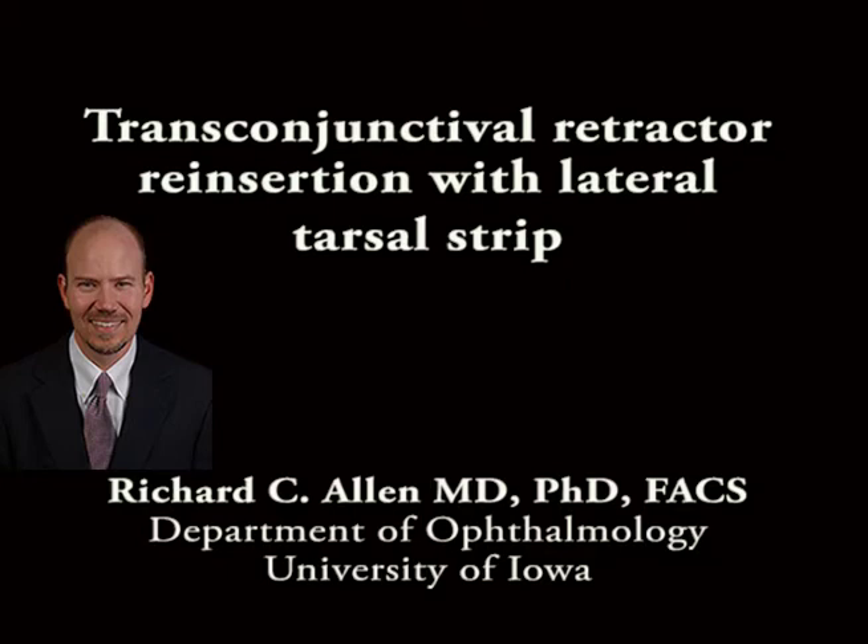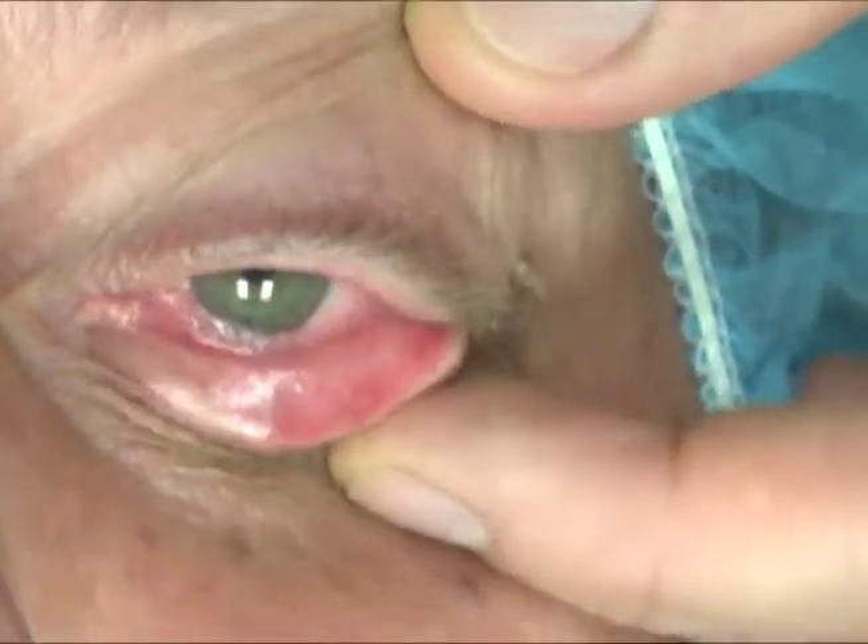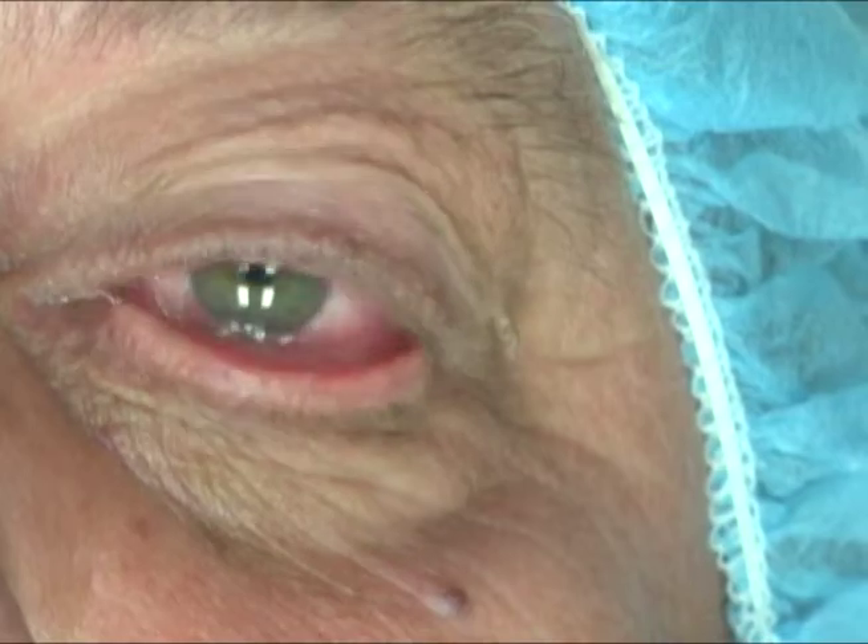This is Richard Allen at the University of Iowa. This video demonstrates a transconjunctival retractor reinsertion with lateral tarsal strip for the treatment of involutional ectropion.